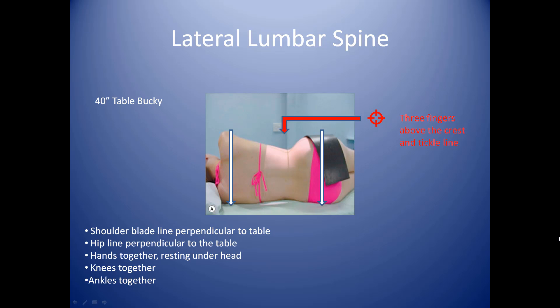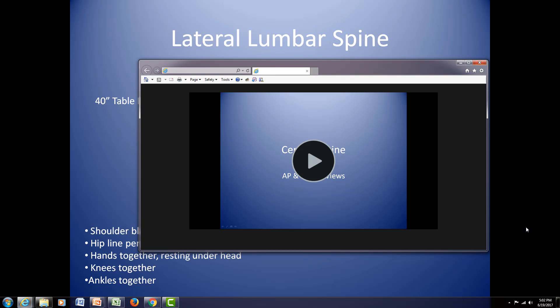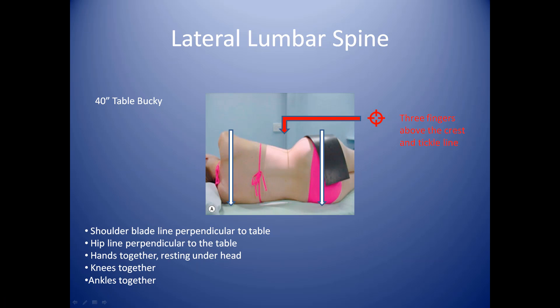For the lateral lumbar spine, we're again at the 40-inch table bucky location. You want to get your patient as perpendicular to the table as possible. To do that, feel the top and bottom scapulas — if they feel perpendicular to the table, you're doing a good job. You also want to align their hips perpendicular to the table, eyeballing the rear end to see if it looks relatively flush in a perpendicular format.